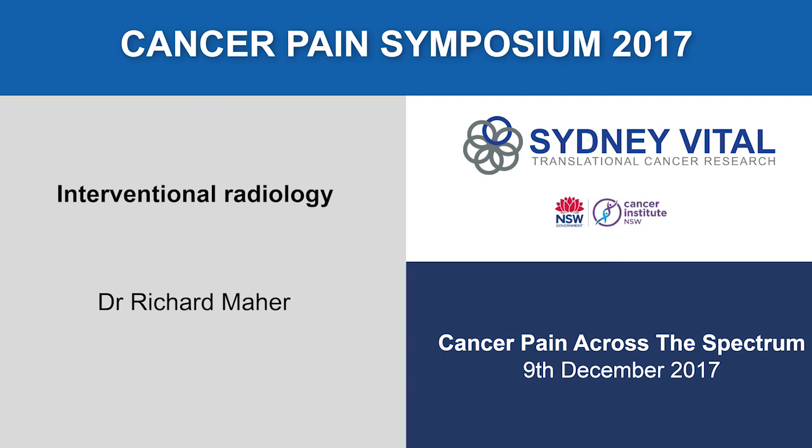I'm talking about intra-arterial treatments, and this is an area of particular interest of mine where we do a lot of embolisation procedures, particularly occasionally in the bland embolisation setting, but often in the preoperative setting to improve the safety of the operation. So painful bone metastases which may require surgical interventional stabilisation for pain control is the main indication, but also to prevent or treat pathological fractures.